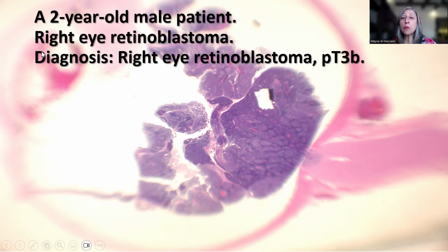Remember that the pupillary-optic nerve, or PO section, is the single most important section whenever we assess retinoblastoma, and we have to go sometimes so many deeper levels until we have a full face of the whole globe, including the optic nerve, in order to be able to assess any infiltration of the optic nerve, whether this was before the level of the lamina cribrosa or post lamina cribrosa.